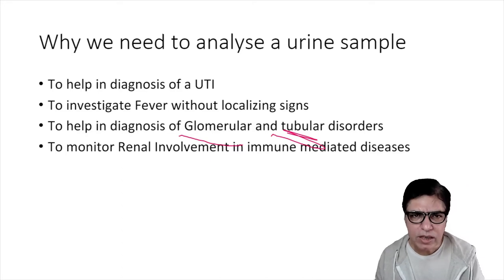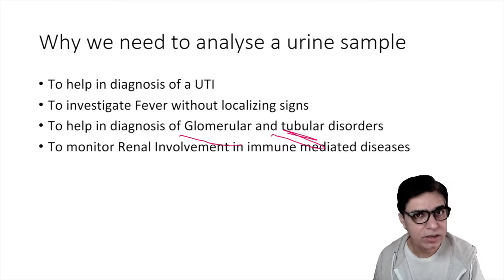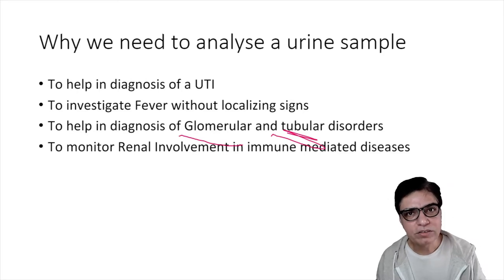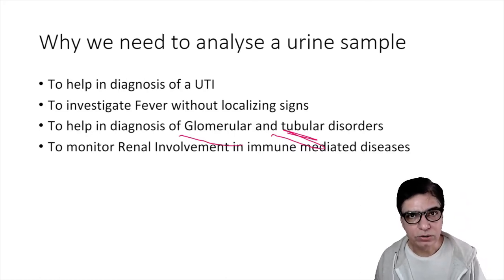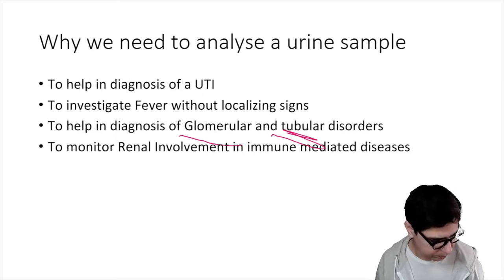And you see, what is the degree of involvement of the kidneys in these diseases? So to monitor that, urine dip is a very simple, non-invasive, inexpensive technique to monitor the renal involvement in these types of disorders. So that's why we need to do dipping of the urine sample. And that's how it helps us in diagnosis of different conditions and even monitoring them.